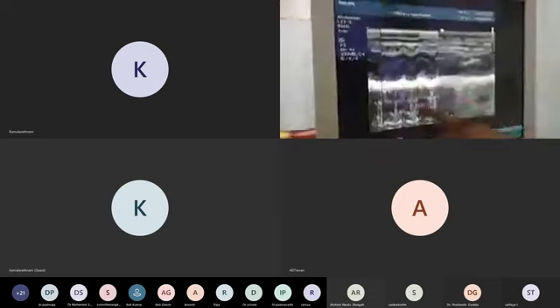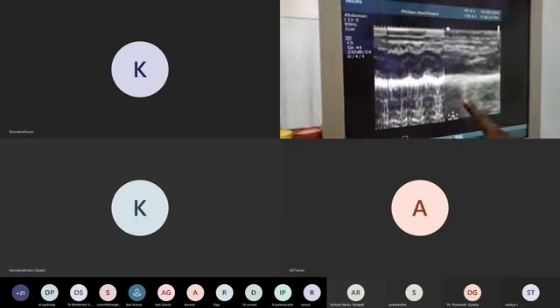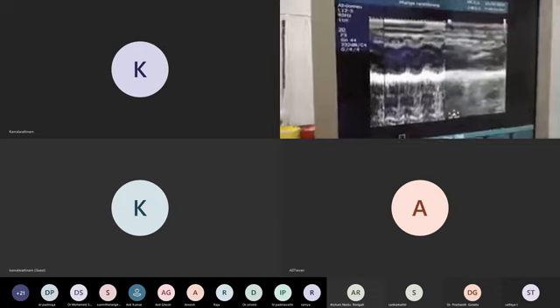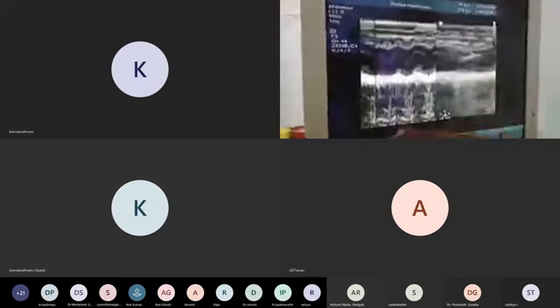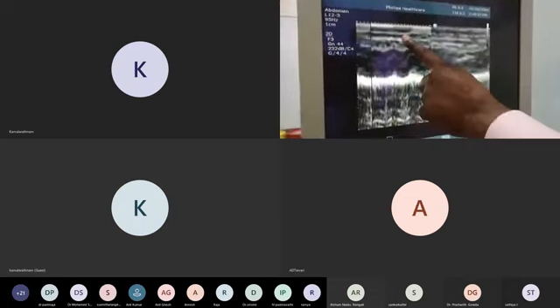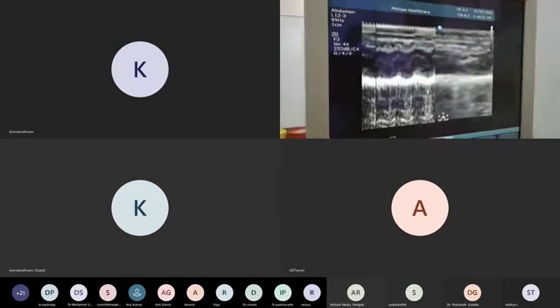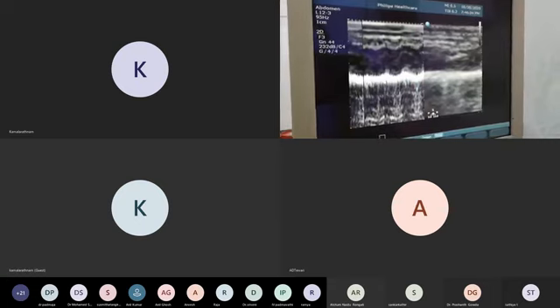This is the shore because this is moving. Ultrasound cannot penetrate the air because ultrasound is a bad enemy to the air. So this is sand because with each movement the lung is moving. It is disturbing and coming, so it appears like sand. So sea, sand, shore. Water is coming. You understand? You people are staying in Chennai. You will know every day how the beach looks.